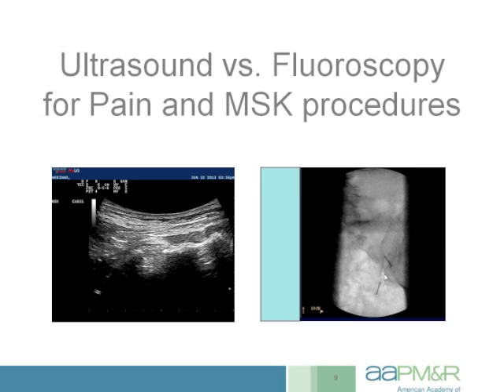And as I'm sure a lot of you are aware who already do these kind of injections in your practice, artifact can be a real issue with sacroiliac injections. In other words, you're not always sure if you're looking at the anterior or posterior sacroiliac joint under fluoroscopy, and sometimes it's challenging. You bring a needle down there, you think you're in the sacroiliac joint, and you're not exactly where you think you are. As you can see, contrasting that with an ultrasound image, you're only looking at the back of the sacrum, and in this particular patient, you can fairly easily see exactly where you need to go. So it helps eliminate that a little bit.